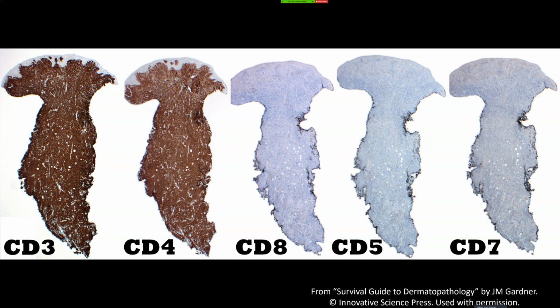So when I see a biopsy that I'm pretty sure is just chronic spongiotic dermatitis, but they're clinically concerned for MF, and there's a couple cells in the epidermis, a lot of times I'll say, I don't favor MF on this biopsy, but I would recommend follow-up. And if this process persists, then repeat biopsies over time may be helpful to further evaluate for that. So I really do think that's important.